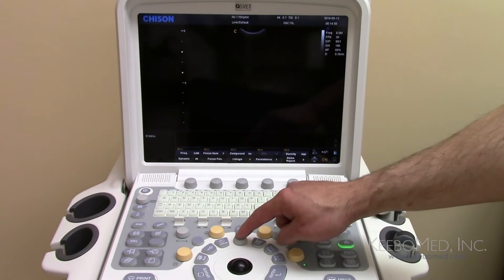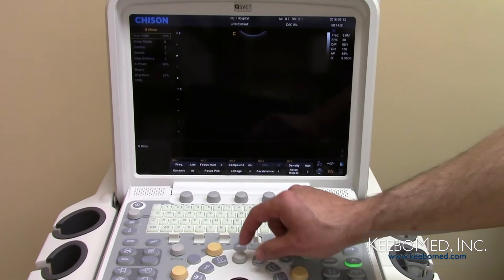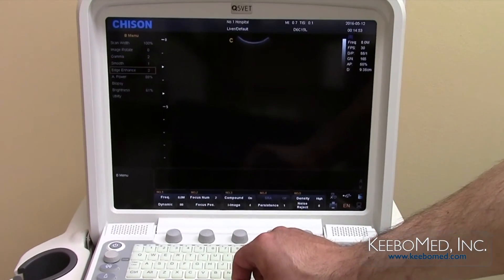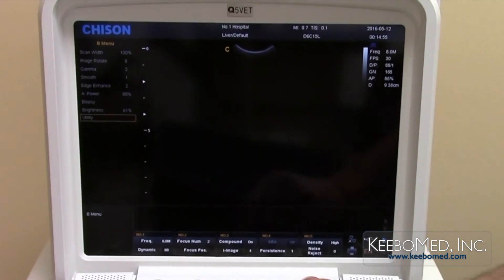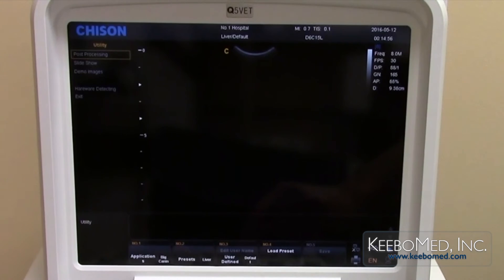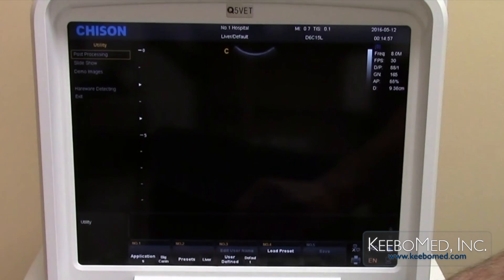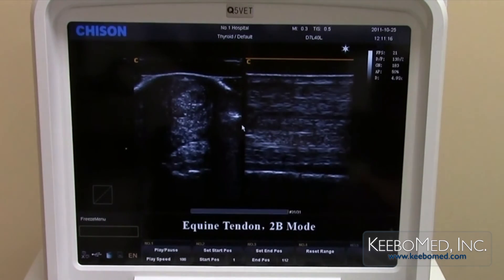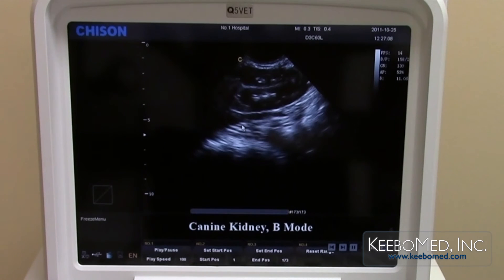Press the menu button, rotate it, and choose Utility. Select Slideshow to show sample images with descriptions that are saved on the system.